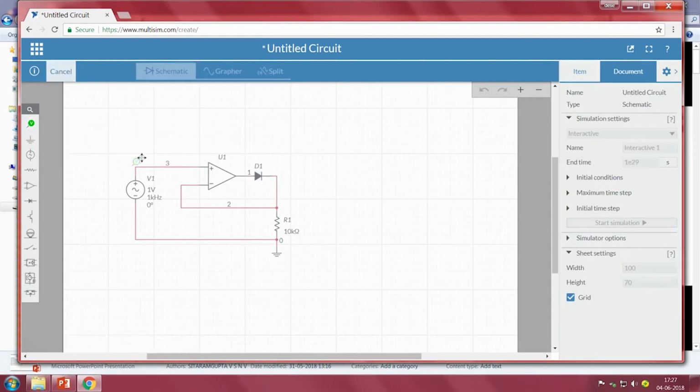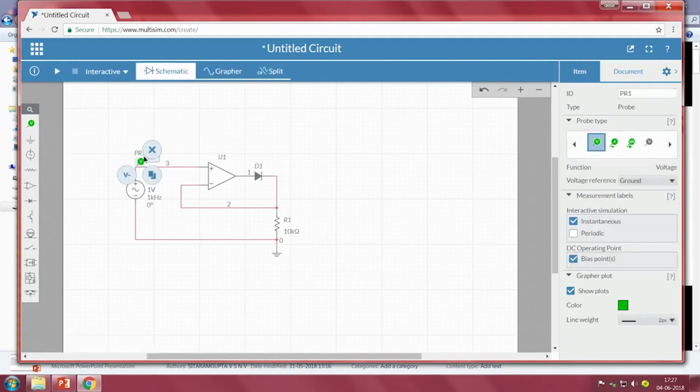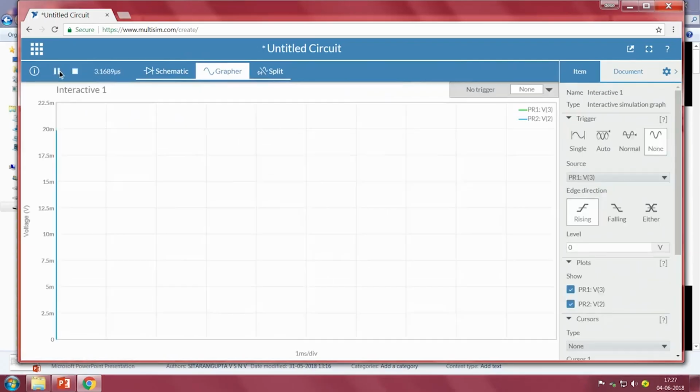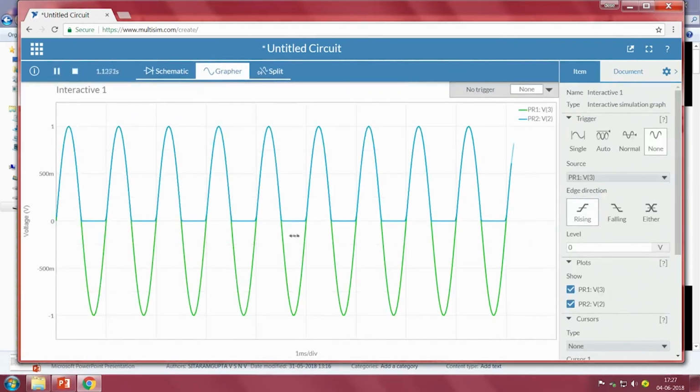Then to visualize both input and output, I am connecting green. Green represents our input signal, and the other one, blue, represents our output voltage. Now, when we go to the grapher and run the circuit, the green is nothing but our input and blue is nothing but our output. The green is a complete wave with a peak to peak of 2 volts, whereas on the output, it was only allowing the positive peaks to flow, and the negative peaks are completely removed.